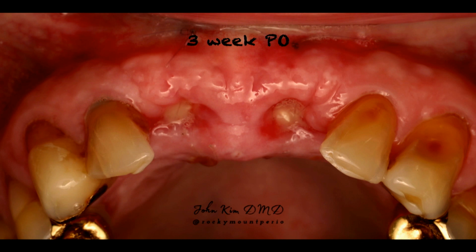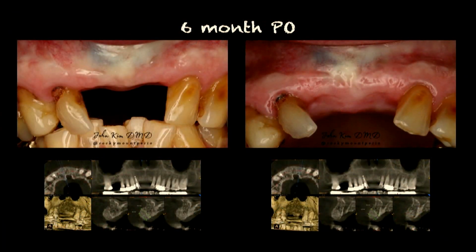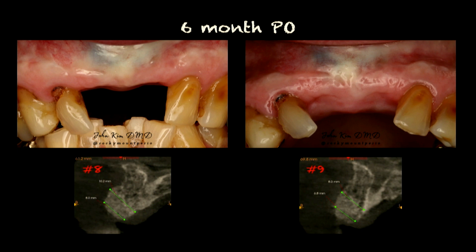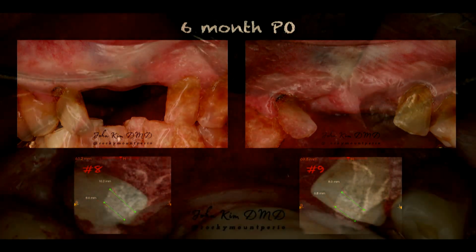And 3 weeks out, still looking good. And 6 months out, as the tissue remodels, I'm very happy with this, at least with the way the soft tissue looks. A closer up view of the CT scan shows that we have plenty of bone here, up to 8 millimeters width on number 8 and 6.87 millimeters on number 9.